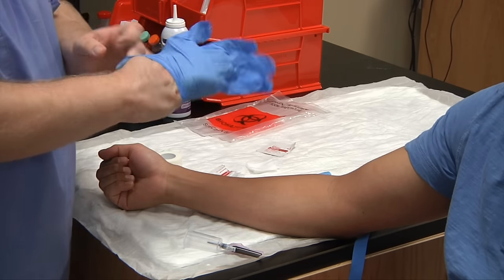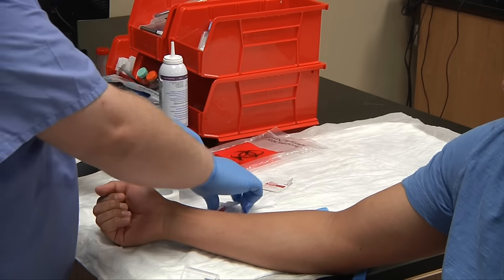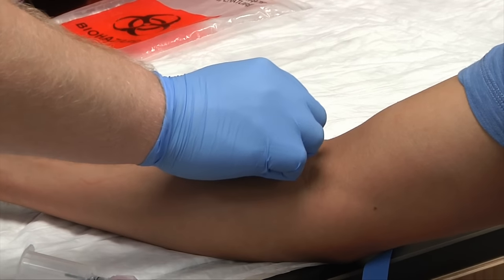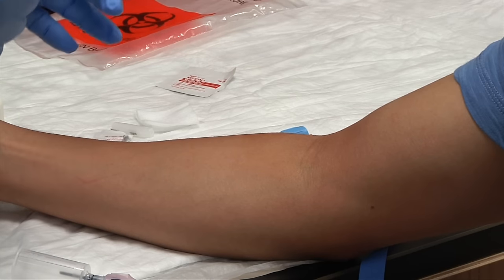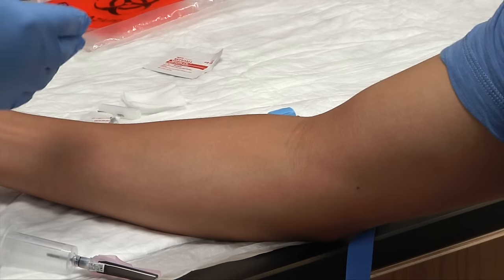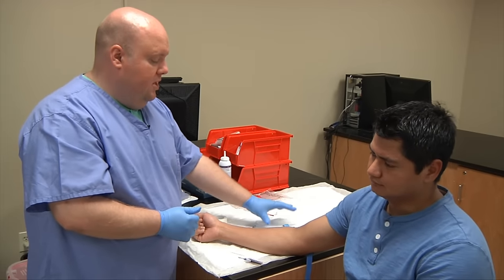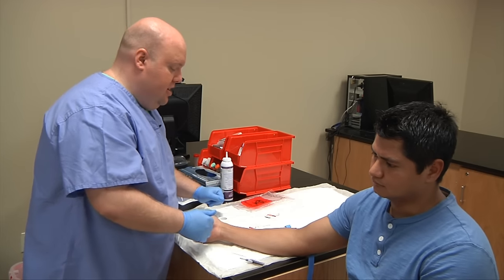At this time, if you do not already have your gloves on, put them on. I'm going to imagine where I'm going to insert my needle — that's where I'll place the alcohol, which is 70% isopropyl alcohol. Start in the center of the patient and do an inside-out concentric method, trying to push the dirt away from the skin. Always check that the alcohol swab comes out clean. If it has a little on it, just take another swab and swab again. Throw the alcohol pad into the regular trash.